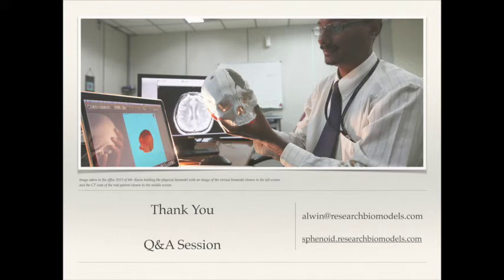What you saw earlier was all in the same material but different colors. Now we're trying this new printer where you can print multiple textures, like rubber and plastic, and combine both. The surgeons are very happy because they say it gives them a feeling of cutting through skin and brain and hitting the tumor, which is a bit harder.